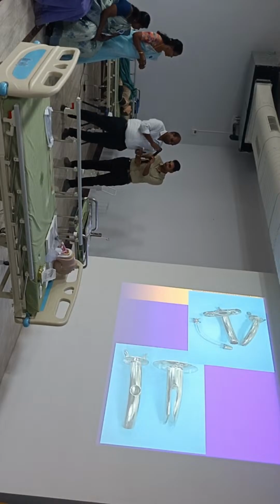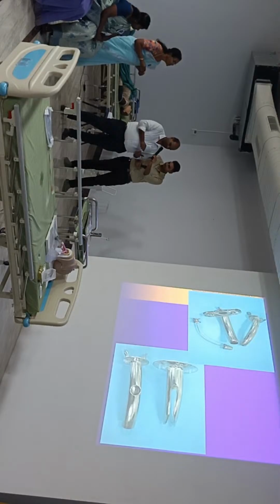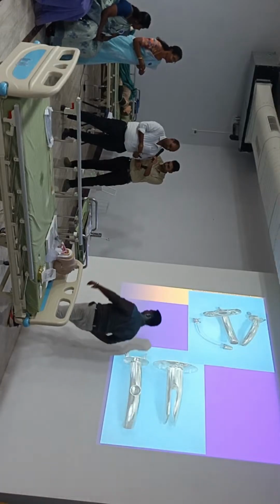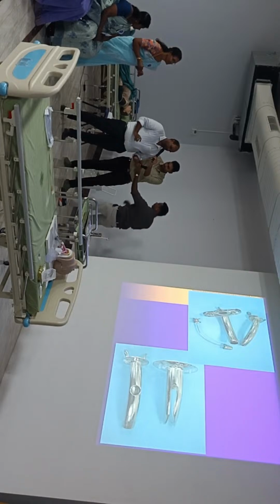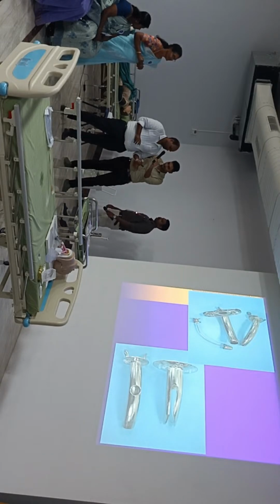This is a Jackson's tube, which is most commonly used in most of the cases in GHS in Tamil Nadu. The main advantage is the tube costs less than 100 rupees. There is a lock here. Unless you remove that lock, you will not be able to take the tube out. Then put the lock back.